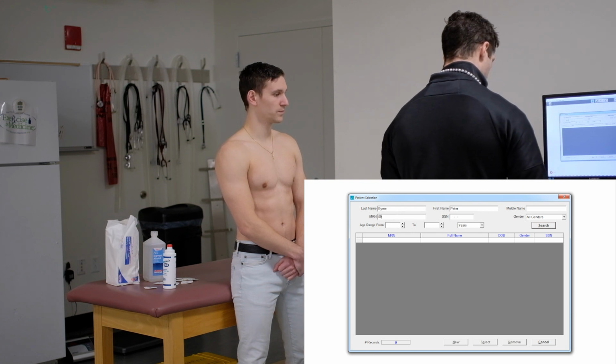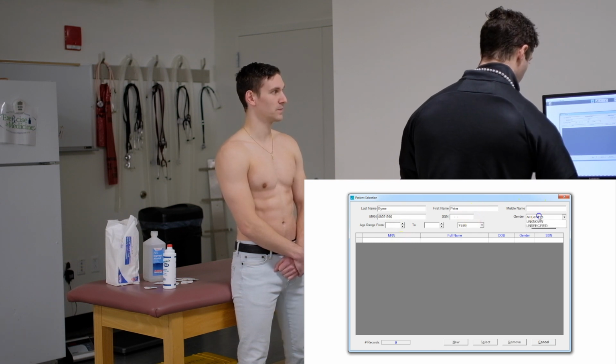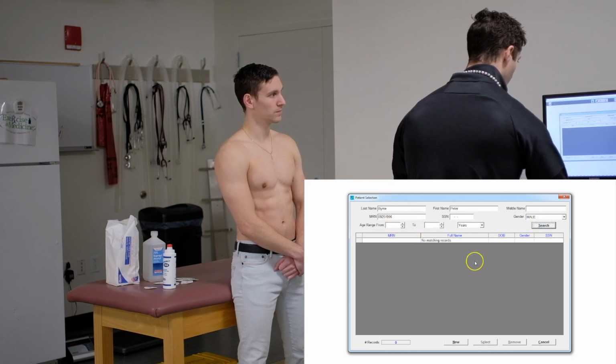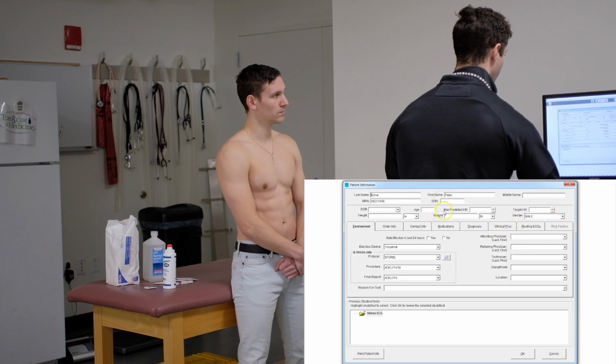So Pete, when's your birth date? 09/25/1996. Alright. We're not going to ask him for a social security number. He is a male. And we're going to go ahead and search. So, he's not there, we'll hit new, and it'll carry over some of that information for us.